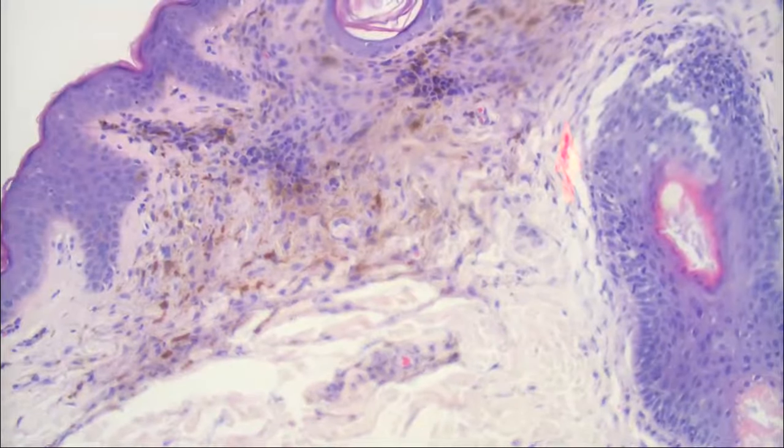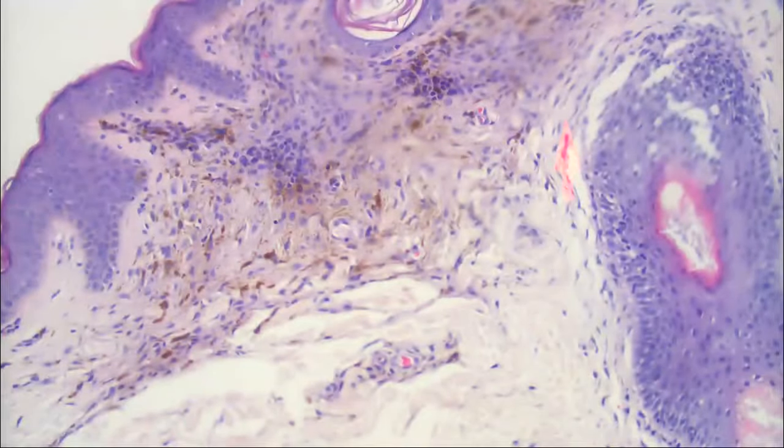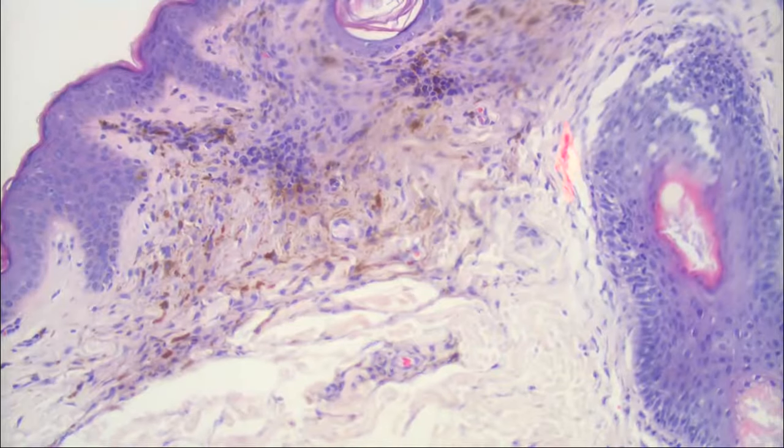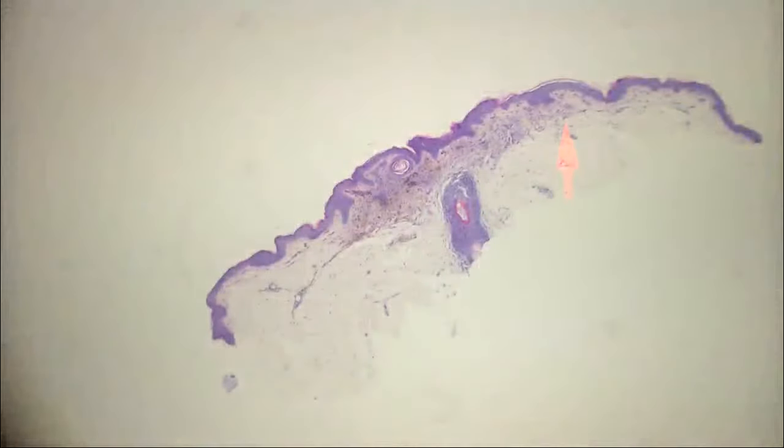But you can get a lot of different types of combined nevi. Combined Spitz's nevus and blue nevus. The blue nevus with pagetoid cells. There's the so-called new BAP1 nevi that we see. Those can be kind of combined nevi. So this is a combined blue nevus. Totally benign. Just kind of a histologic variant, if you will. Okay, very good.